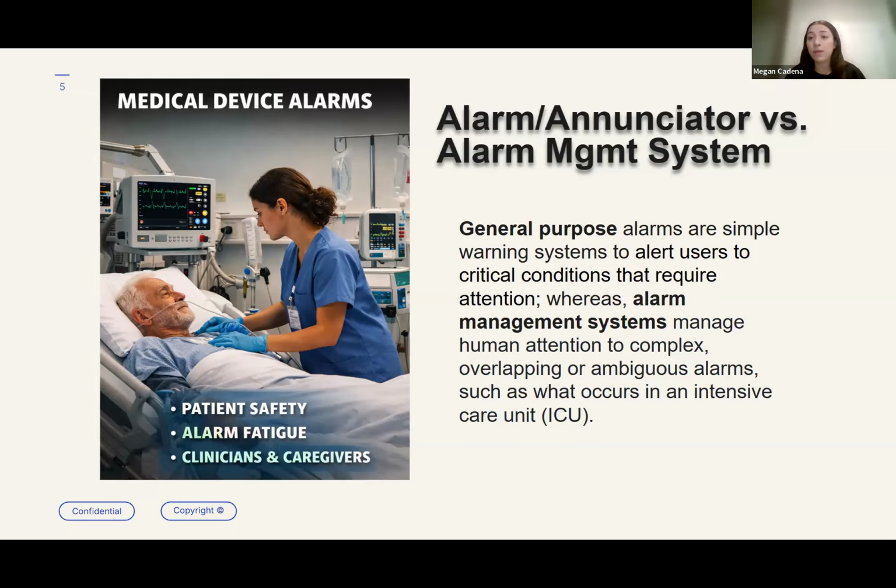One patient treatment may be completely different from how the same treatment goes on another patient, or even a different modality. As someone who works on acute renal devices, I see that there are multiple modalities for therapy to be delivered on the same machine. Of course, you're going to see different alarms with every therapy run, but even for the same modality, different responses, like to high pressures, can lead to other consecutive alarms. That's the beauty of alarm management systems: they can create different state systems to respond in prioritization to an initial stimulus that leads to a cascade of different events.